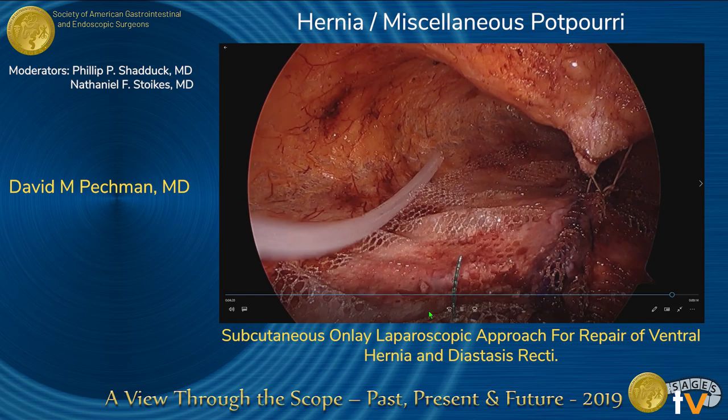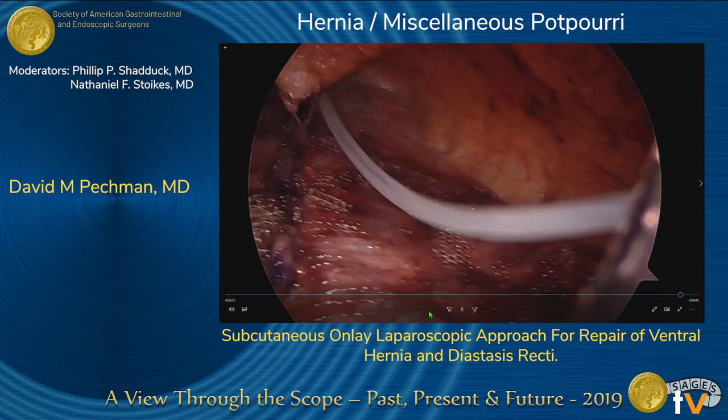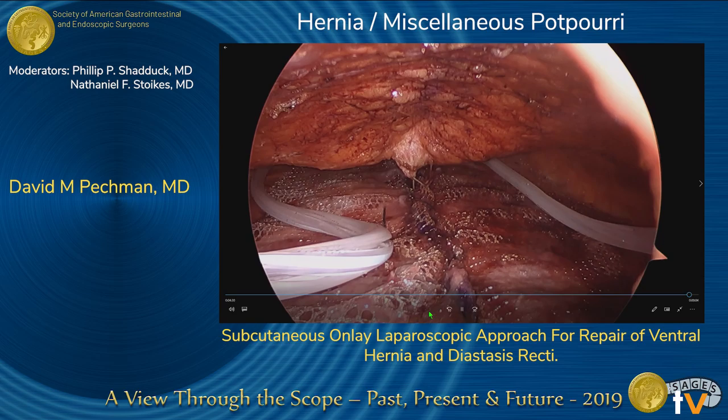Two 19 French Blake drains were placed in the subcutaneous space to avoid seroma. The subcutaneous space was deflated under direct vision and the skin incisions were closed.